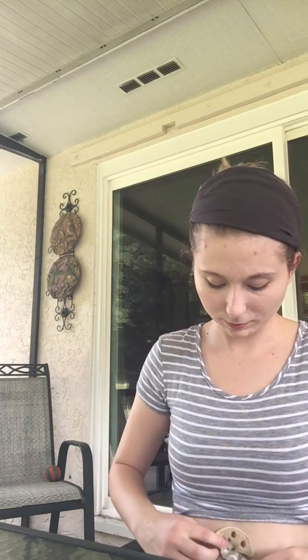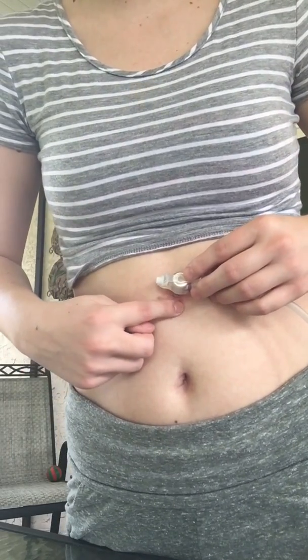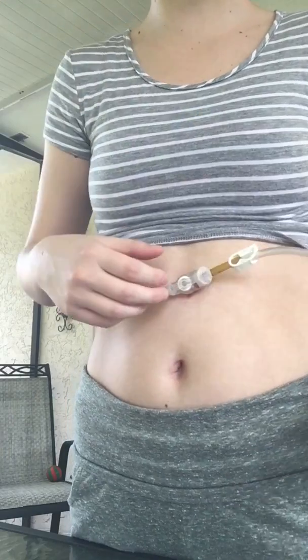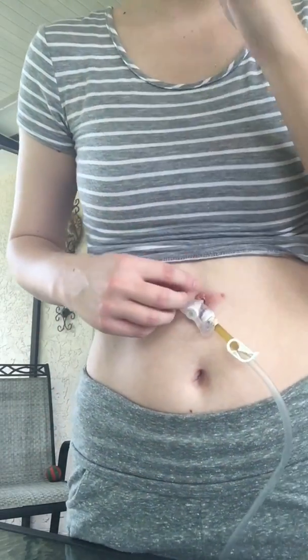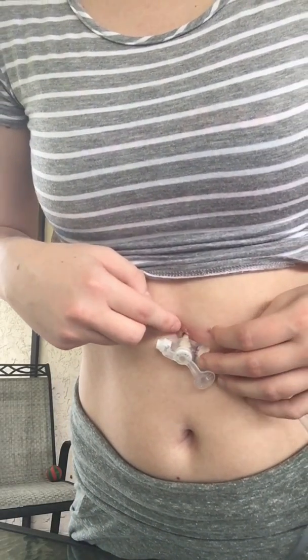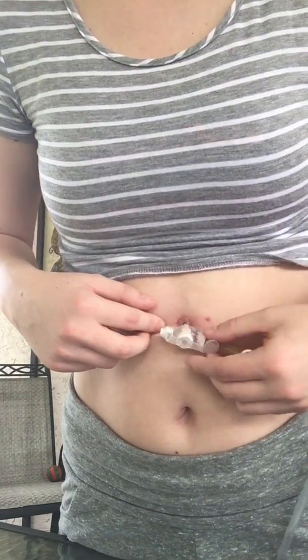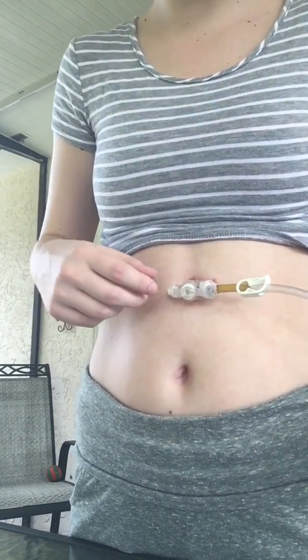I'm gonna take my 2x2 pad off and I can show you. When I first got it, I had sutures here, here, and here that kept it attached to the abdominal wall until the tract formed. After 10 days, I could take them off. And then, as you can see, that little bit of tissue right there is granulation tissue. I had a ton. The rest I actually burned off with alum powder.